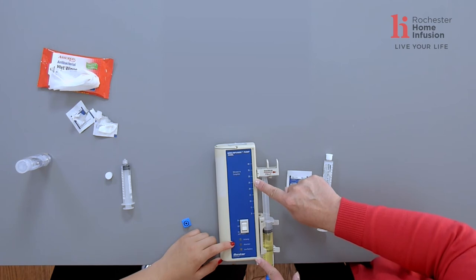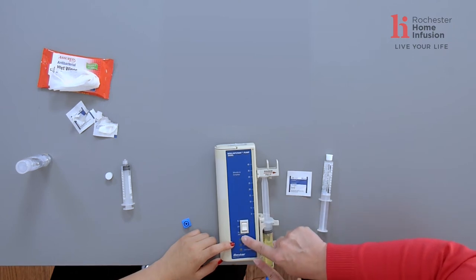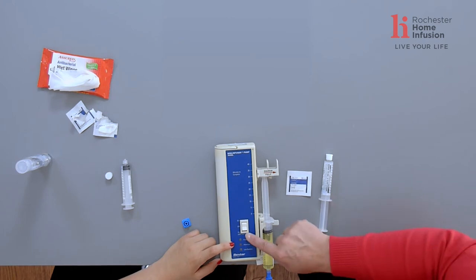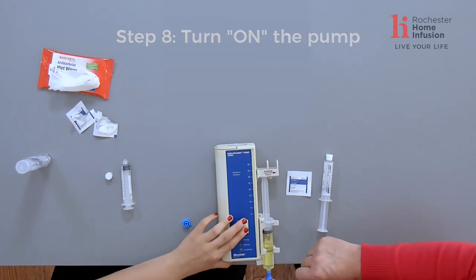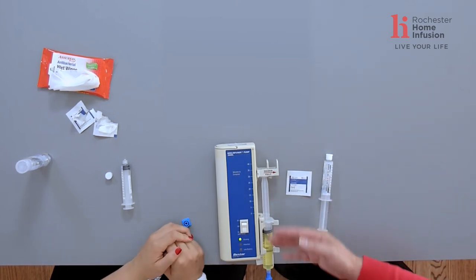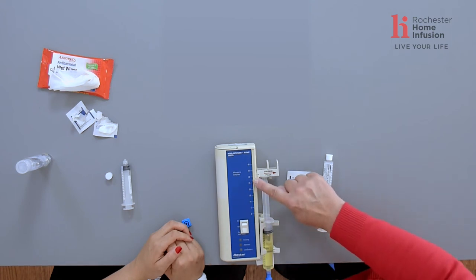Towards the bottom of the pump, you have on and off buttons — one is on/off and one is on with an alarm. The on-with-alarm button will beep when the syringe is empty and the infusion is complete, so you know it's done. Go ahead and turn that on now. Very slowly, the lever will move down and push that medication in — you won't need to hold it. We know it's going to take 30 minutes.